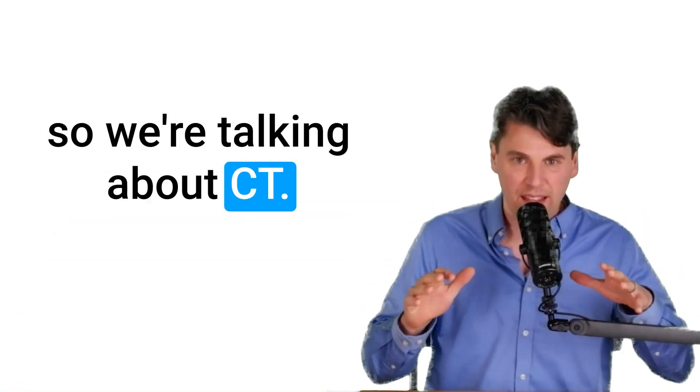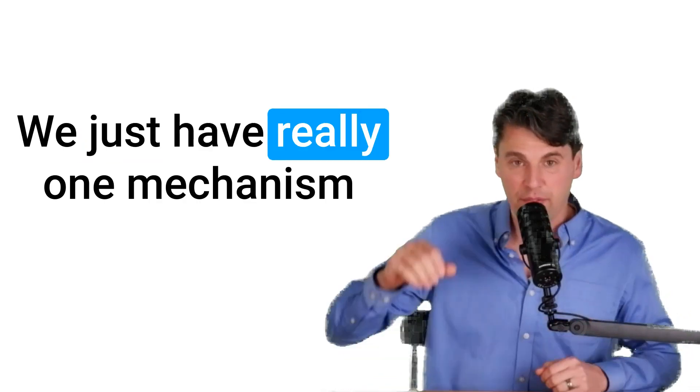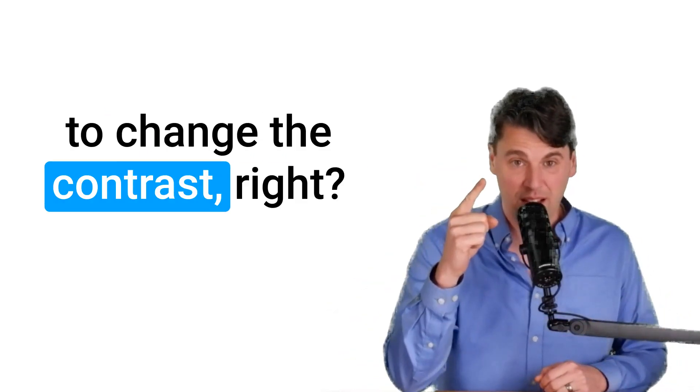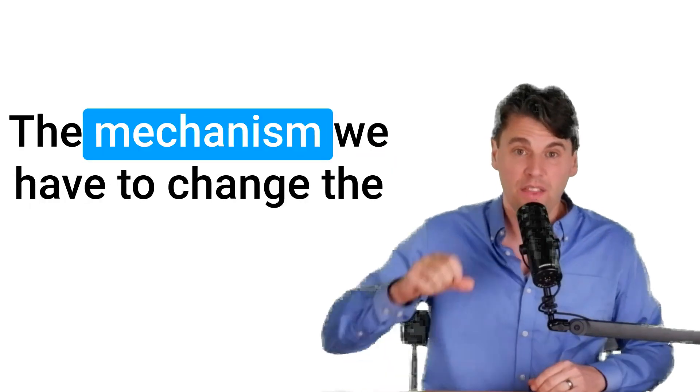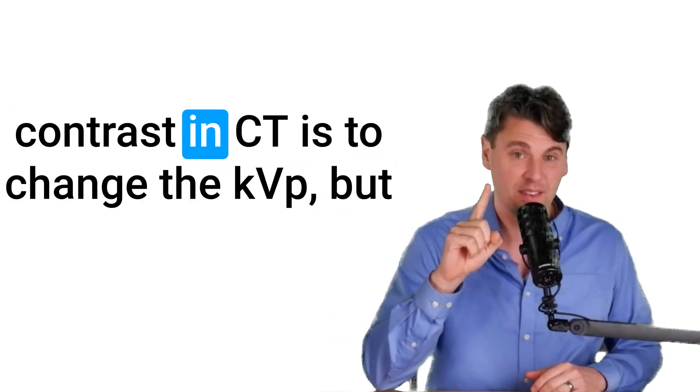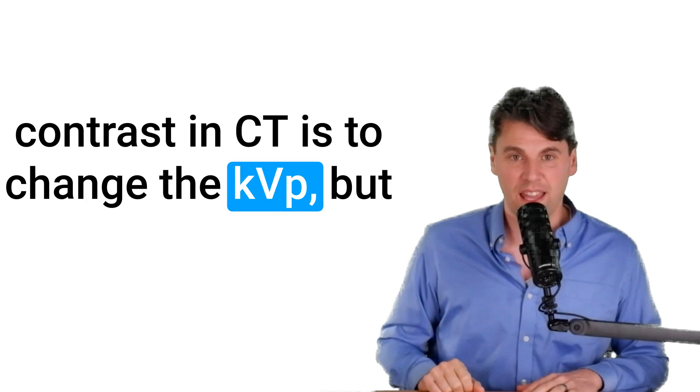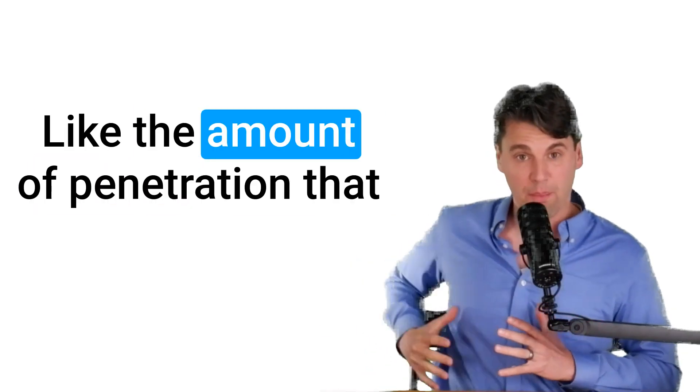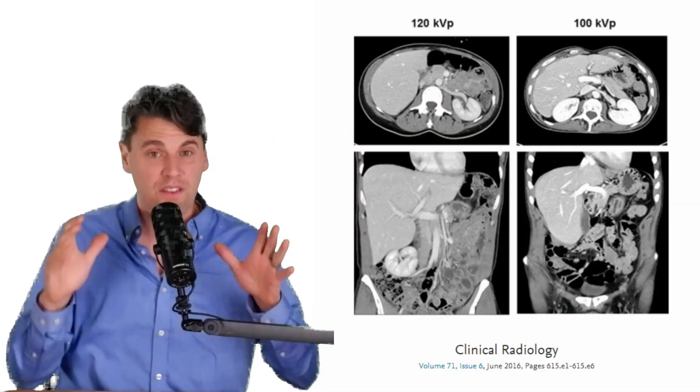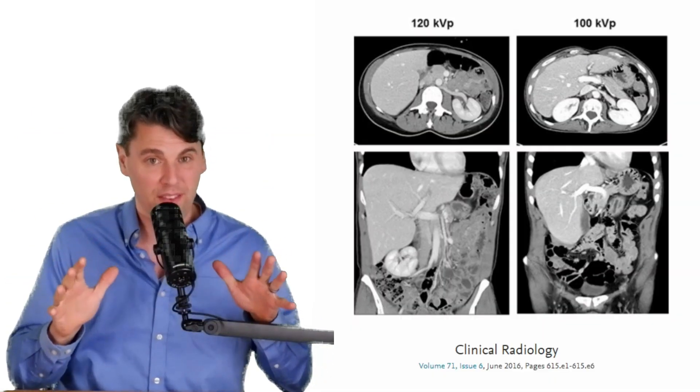So we're talking about CT. In CT, we just have really one mechanism to change the contrast, right? Besides injecting additional contrast, the mechanism we have to change the contrast in CT is to change the KVP. But that also changes other properties, like the amount of penetration that we're going to have. See our video on KVP if you haven't seen that already.